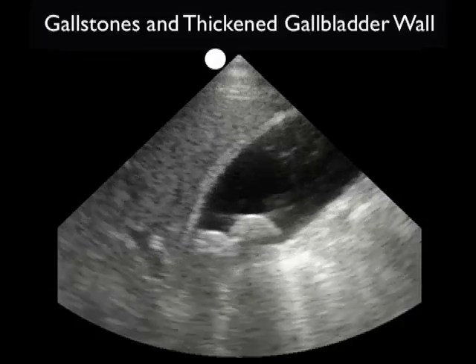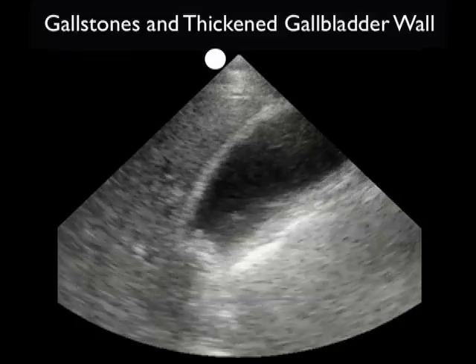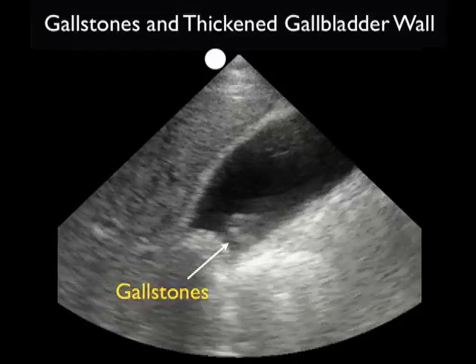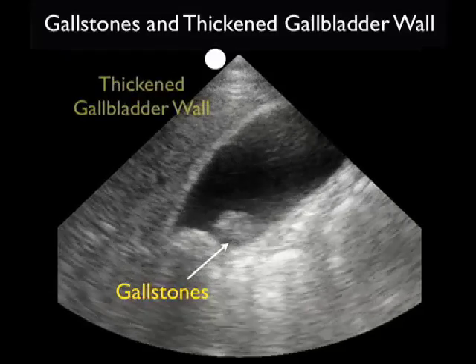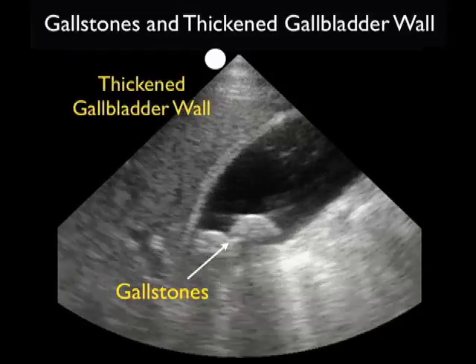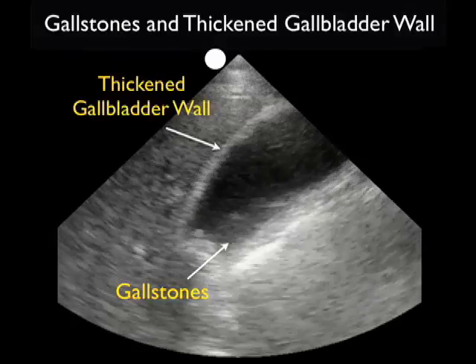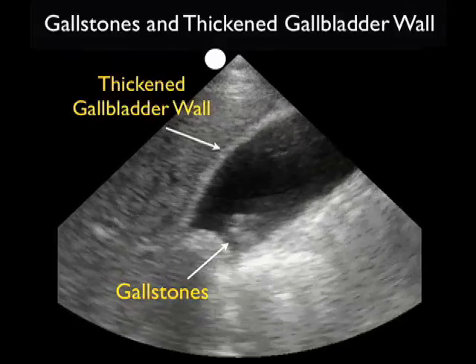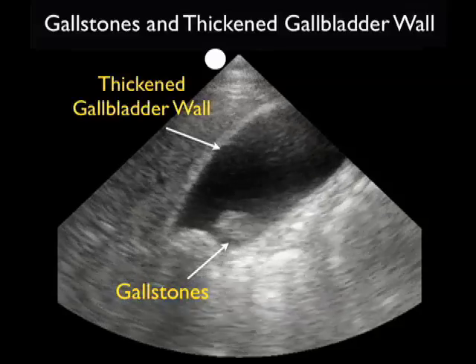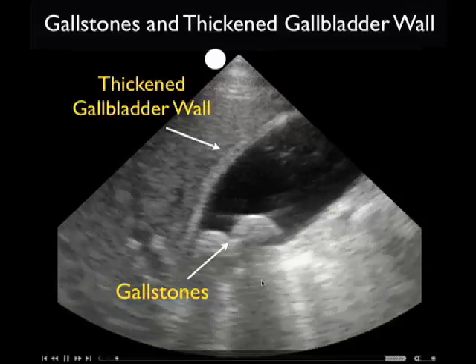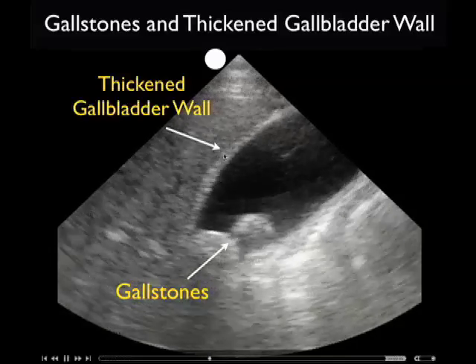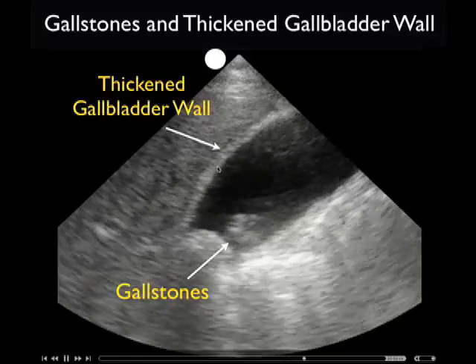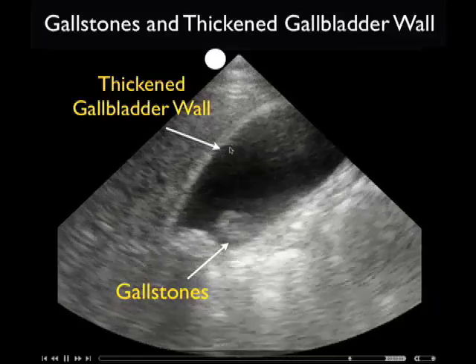Here's a video clip from a patient who presented with right upper quadrant pain and fever. As we look at the gallbladder, the first thing we see is the presence of multiple gallstones within the neck of the gallbladder. Also, we're going to examine here the anterior wall of the gallbladder, and notice with the small indicator arrow, I'm just pointing out that anterior wall.